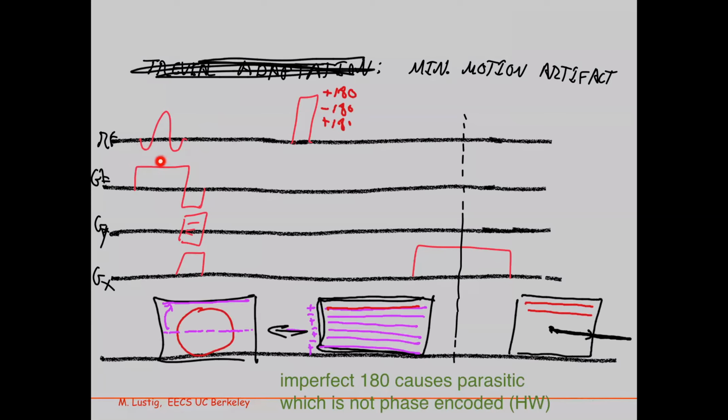The rest of the volume is not excited. Now you apply a 180. That refocuses that slice, but it also inverts the rest of the volume, right? The rest of the volume has an MZ up. Now after this 180, this is non-selective, right? So everything would invert. Now imagine if it's not inverted perfectly, that means there's still some MXY components left from outside of the slice.